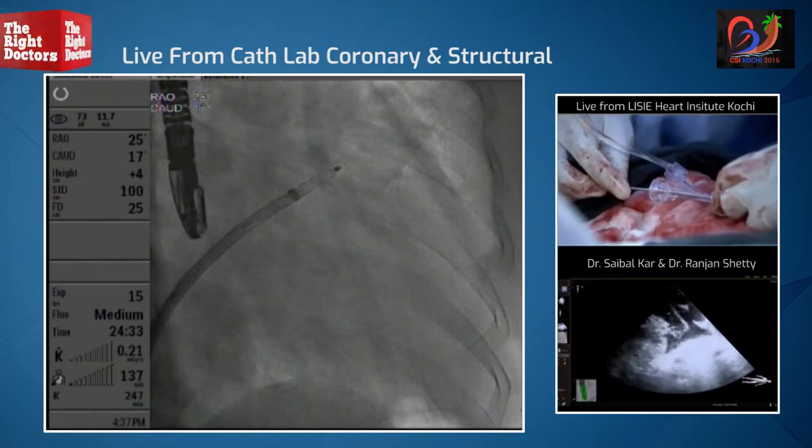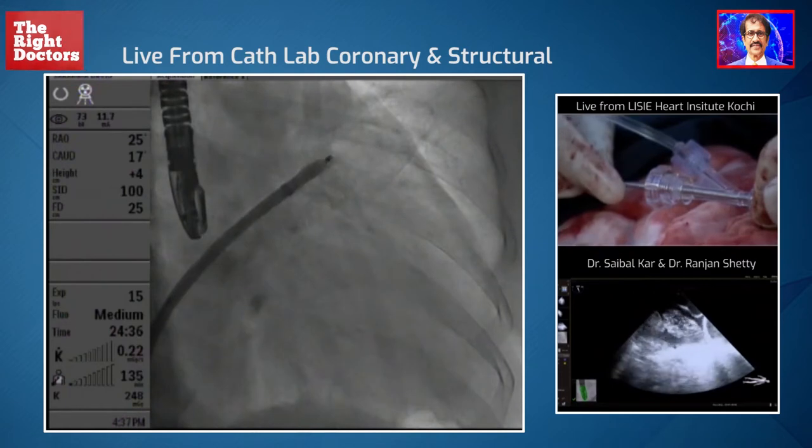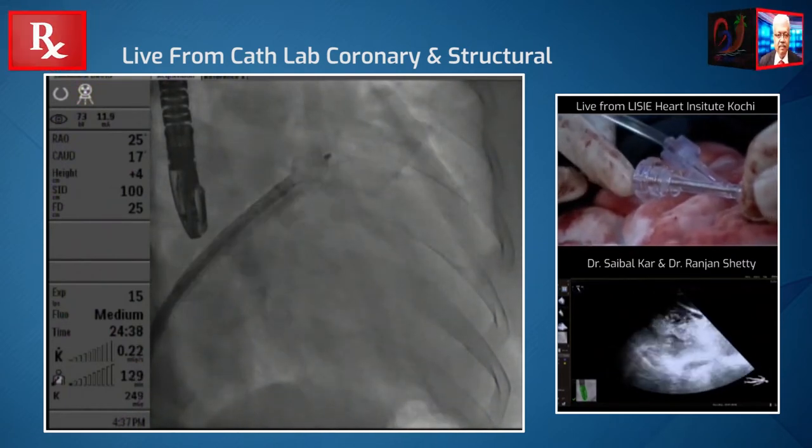So you can see — okay, 135, not 90, 135. So we're just giving a test, and I'm going to make it a ball, so that looks quite nice.